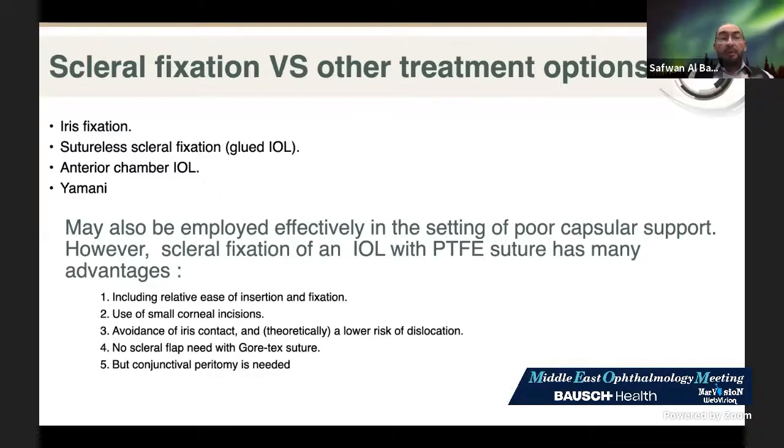But when we compare iris fixation to scleral fixation, sutureless scleral fixation, glued IOL, anterior chamber IOL, and Yamani, the reasons I use scleral fixation with the Gore-Tex suture include relative ease of insertion and fixation, and use of a small corneal incision, as we will see.